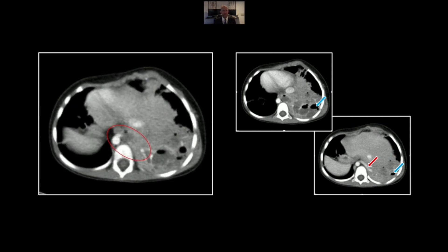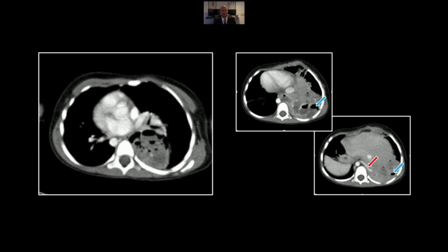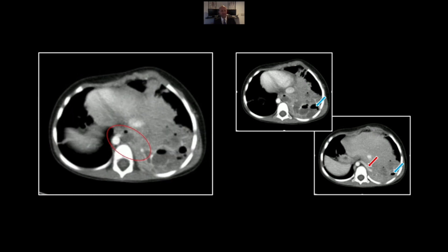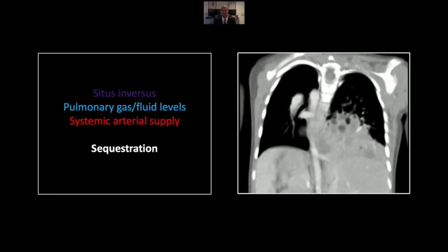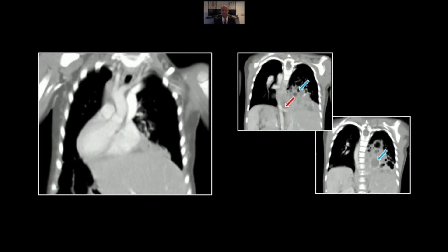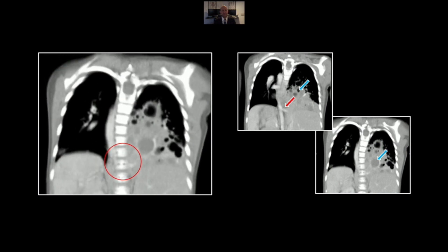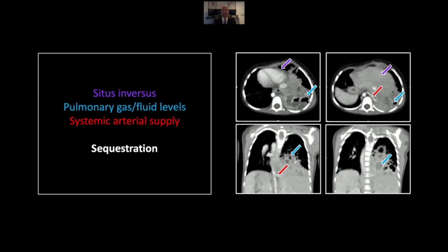There's the sequestration and there is that all-important systemic arterial supply. The presence of all those fluid levels suggests extensive superinfection, a common complication of sequestrations. Here it is on the coronal — again the gas and fluid collections and the origin of that systemic arterial supply. So that is an infected sequestration in a patient with situs inversus.